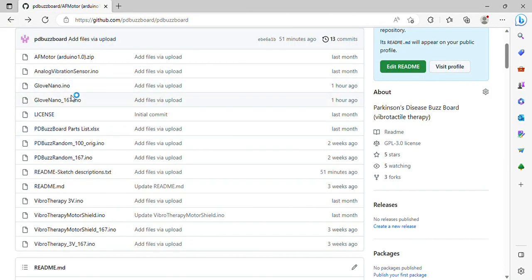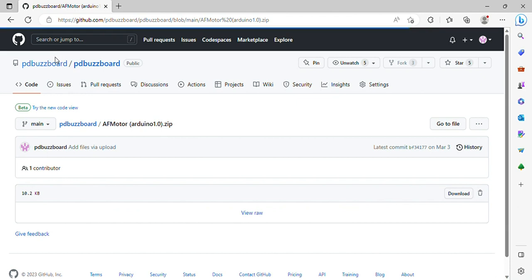If I go to the motor shield library, you'll see it's a zip, so I just hit the download button.